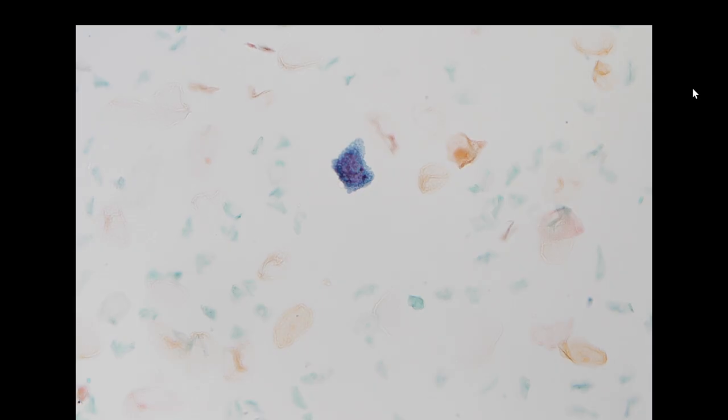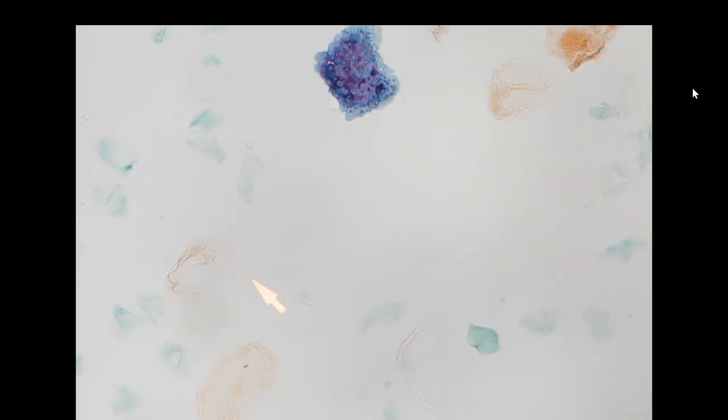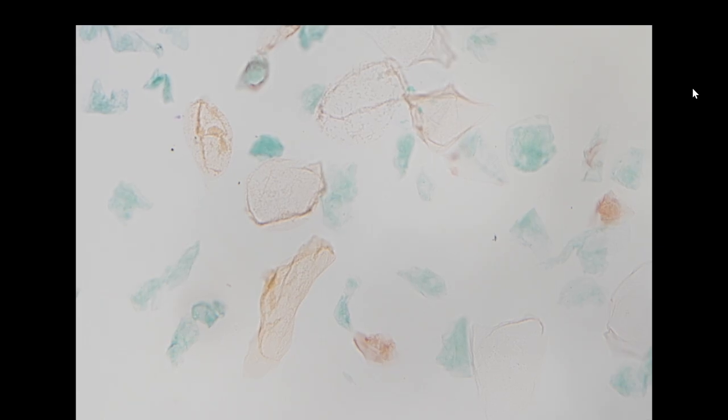So I think for this case, we will call this negative. There was some interesting material. I think this is not a cell. I don't know what it is, it's very, very weird looking material. But we don't see atypical squamous cells because there are no cells with nuclei. These cells don't look necrotic. It looks like they are at their end differentiation. So for this case, I just call this negative.